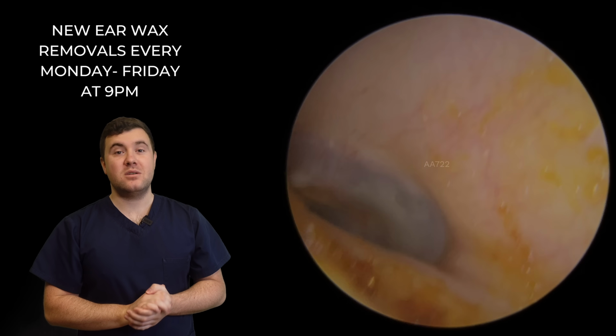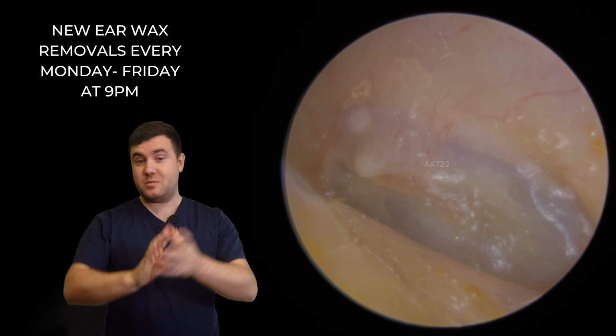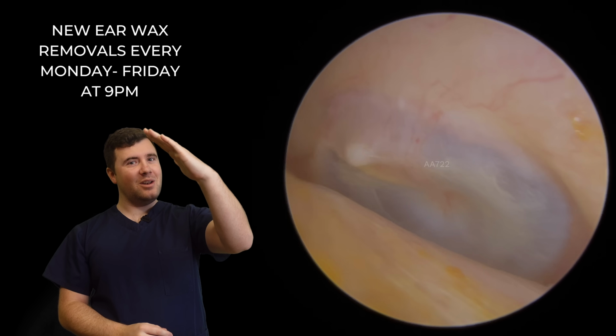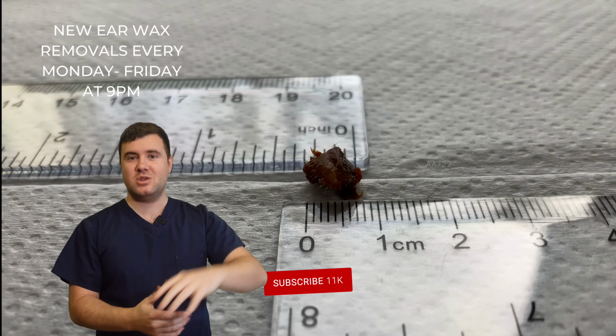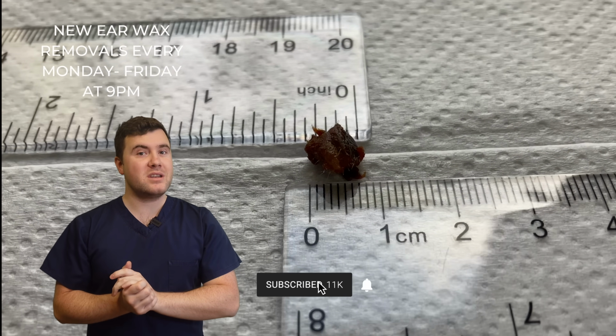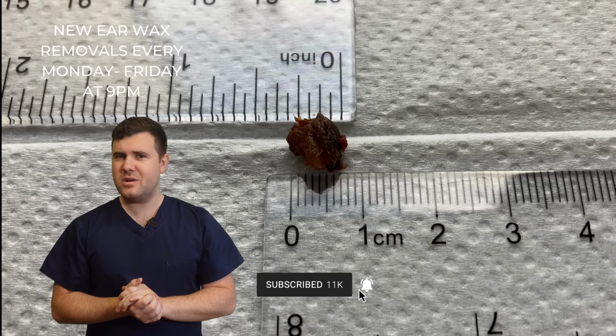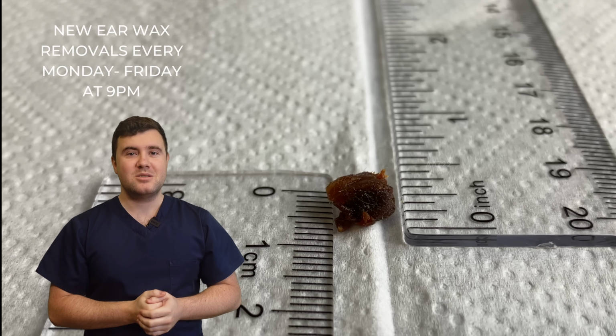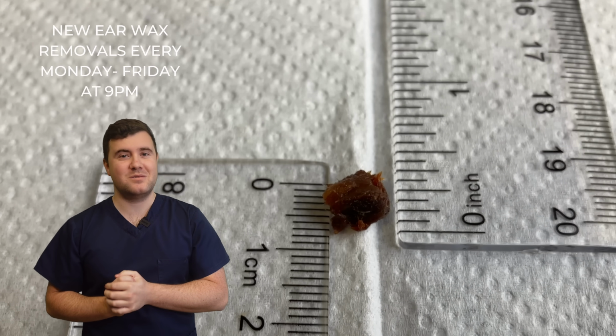So we're just going to clear. Oh, there we go. I thought we were going to clean up some little bits, but it's actually nice and clear. Perfect. We got quite a steep angle on that eardrum there, which is not abnormal. And we got a nice little plug there. We got a quarter of an inch, just under 1 centimeter. So it's a nice easy one there to finish the video off.